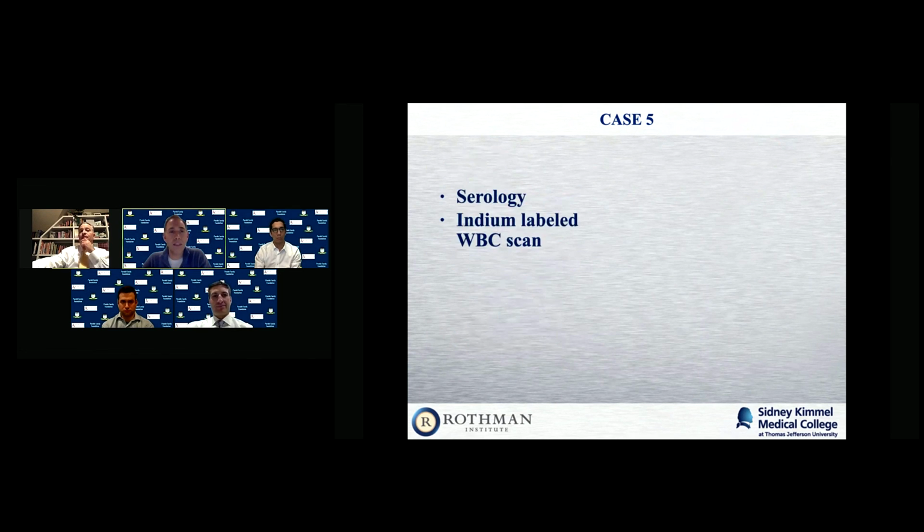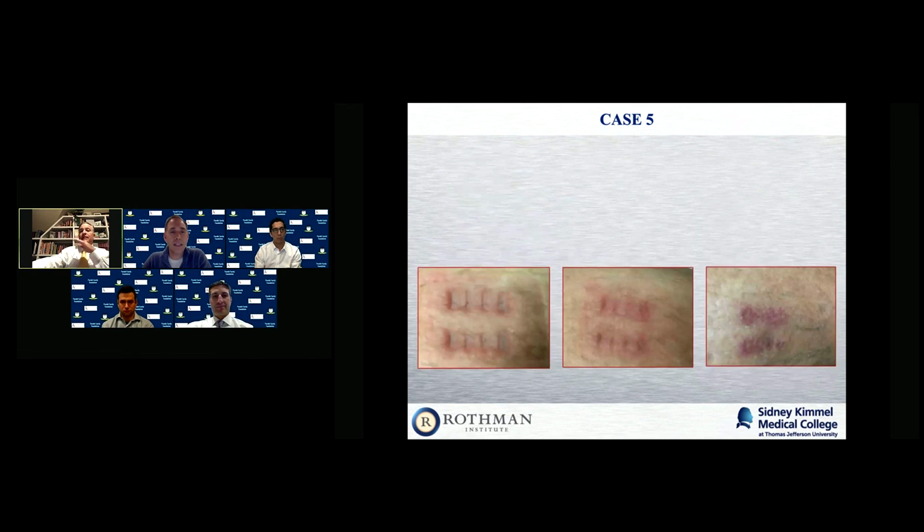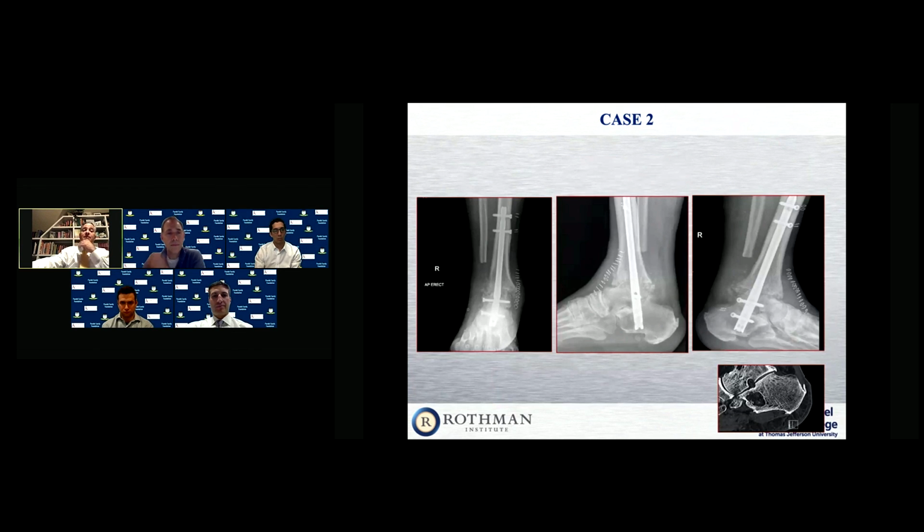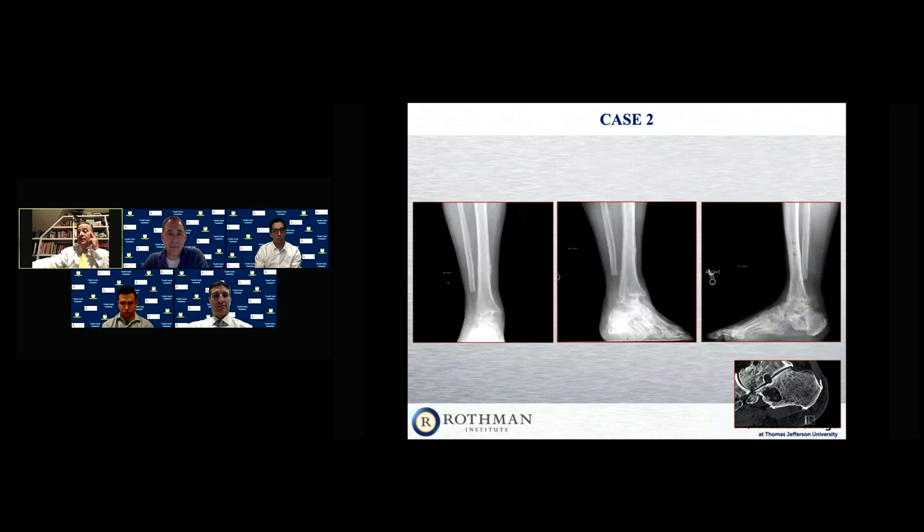Okay. So bottom line is serology is normal. My concern was that he was having an allergic reaction to his implants. I sent him to an allergist, and he was actually found to be positive on the undersurface of his STAR, but not on the articular surface. So before taking him to an ankle subtalar fusion, I gave him an IM nail. I sent him back to the allergist. That was found to be negative on 3 passes. And I did an ankle subtalar arthrodesis with eventual implant removal. The man's retired in Florida.